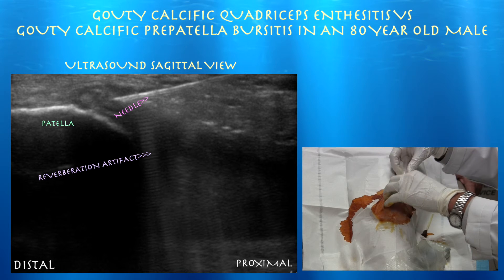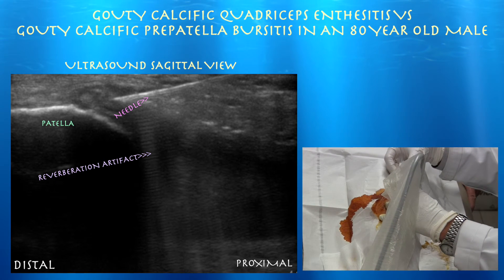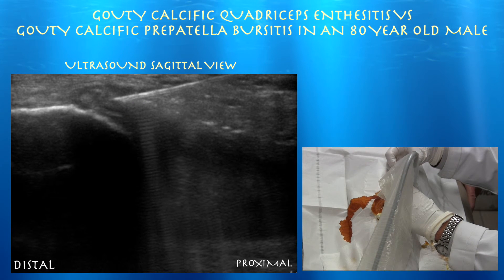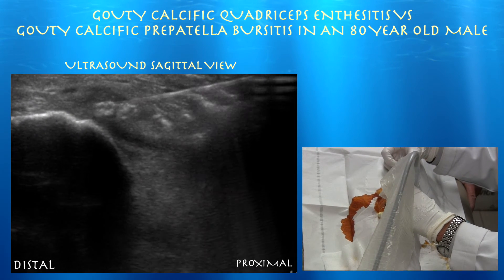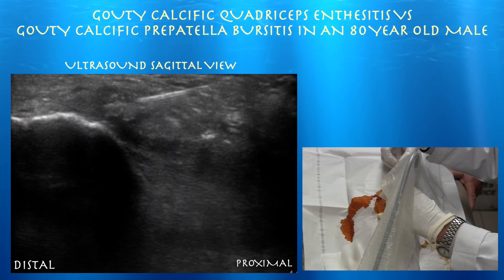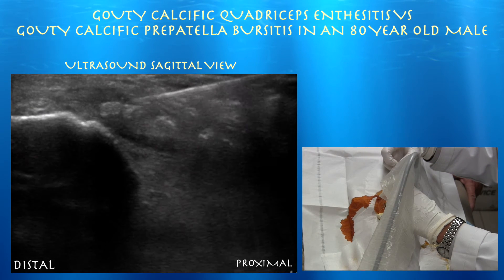Here's some saline — going to flush it out and take some saline into it. You can feel a little grittiness to it, and that's all that calcium.